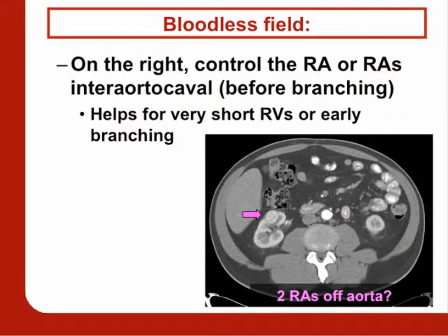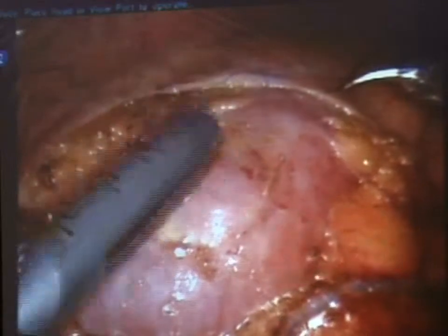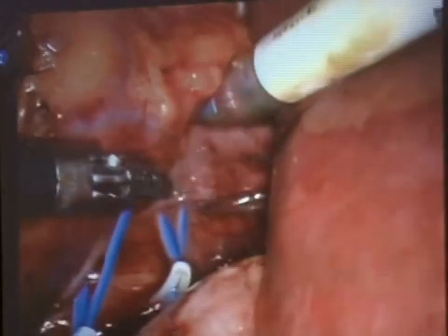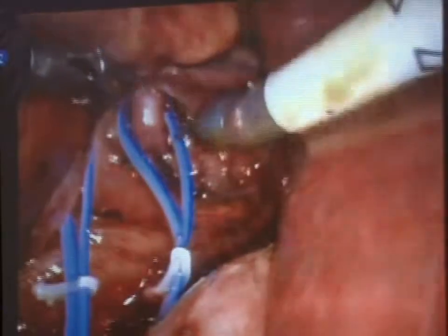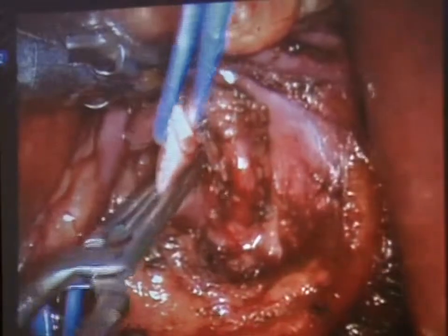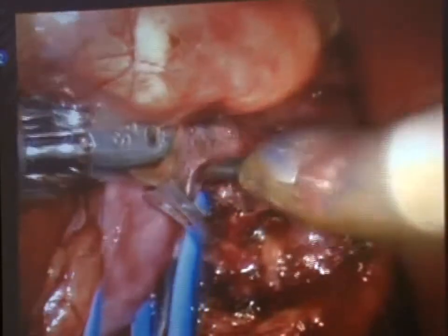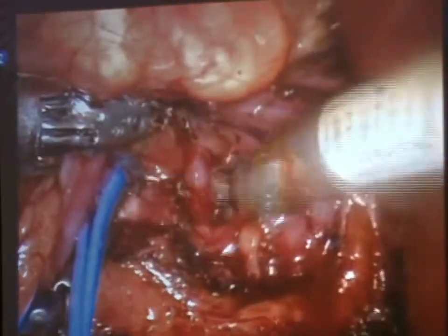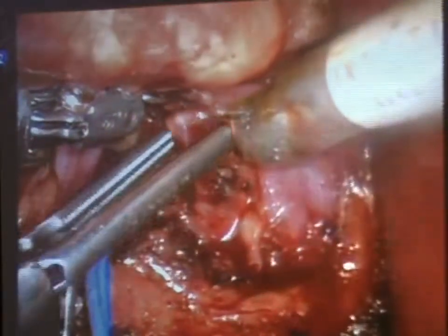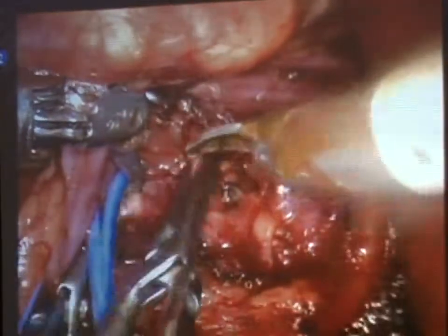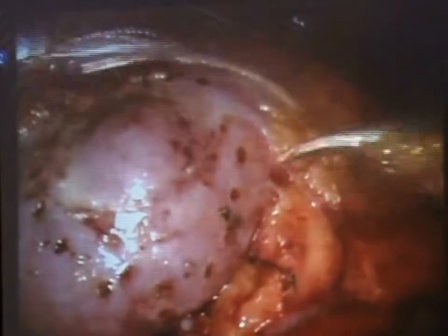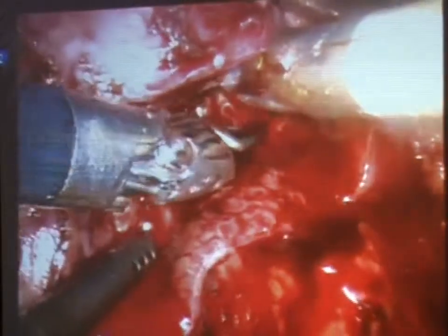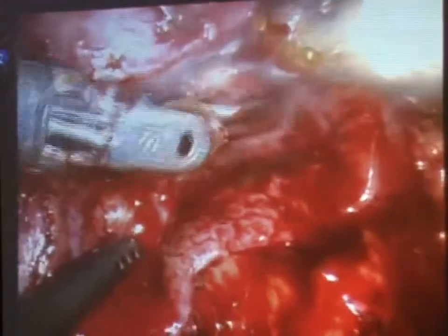On the right side you can do the same thing — it's a little more difficult to work right on the aorta, but you can go interaortocaval. Here's an example: the scan suggested the patient had two renal arteries, but what I found was actually three arteries. So I insisted on going interaortocaval, working right on the aorta, because I wanted to make sure the blood supply to this kidney was completely controlled. This is also a good technique if you have an early-branching artery — control it interaortocaval before it branches. Now we have a completely bloodless field to resect this completely endophytic tumor.